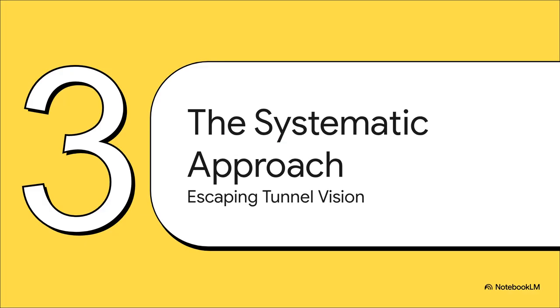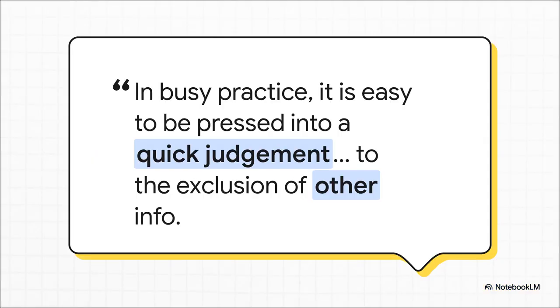Okay, so now you know the language, you know the landmarks, but let me tell you, the single biggest mistake anyone makes in interpretation is getting tunnel vision, where you only focus on what the patient is complaining about. To be a real diagnostician, you absolutely need a systematic process. And this quote, man, this really hits home for anyone who's ever worked in a busy clinic. The pressure's on, right? It is so easy to just make a snap judgment. A patient comes in, points to a sore tooth, and boom, that's the only thing we look at. But that kind of habit, that's how you miss something really bad, like an early-stage malignancy or some other critical finding on the total opposite side of the image.